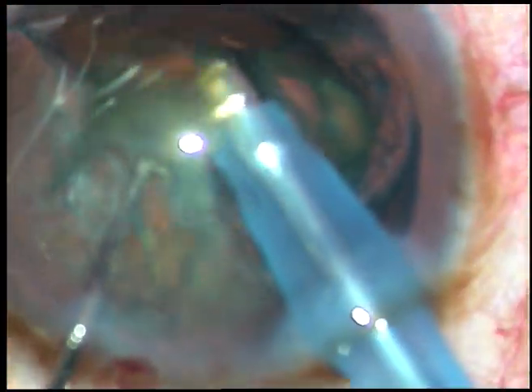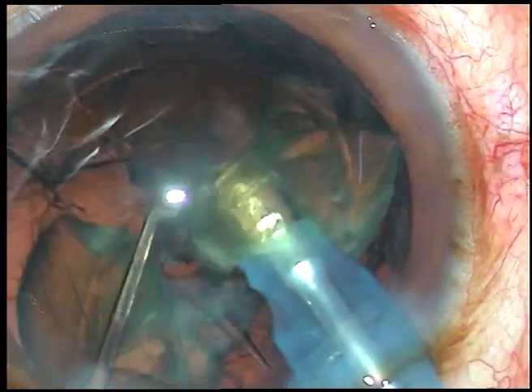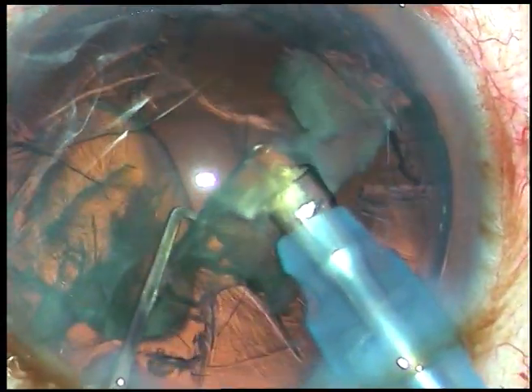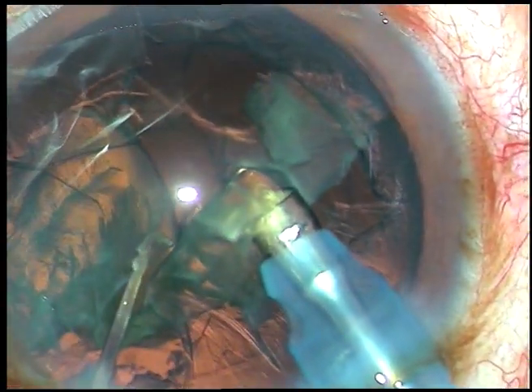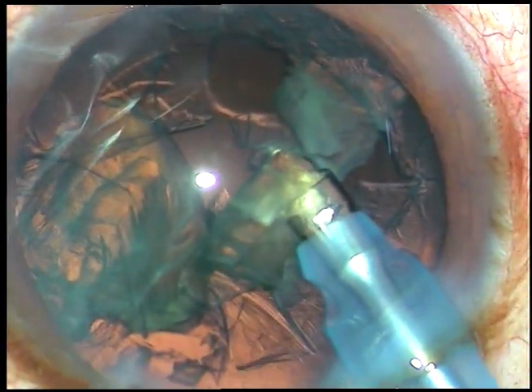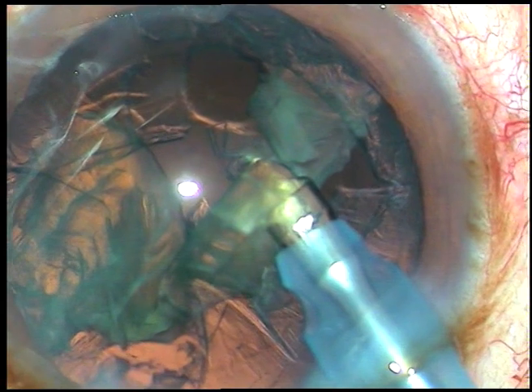But see what happened here. I have chopped the nucleus and now I am trying to emulsify it, and suddenly there is a rent at 6:30 o'clock.